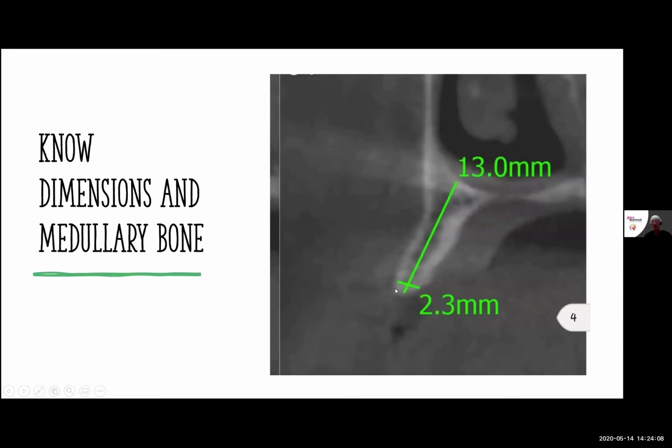And so I am not talking with this technique of growing a little bit of bone like this. Another millimeter of bone is going to do us nothing except cause irritation to the patient. This patient needs to have 6 to 8 millimeters of bone growing on the facial surface of this in order for us to consider placing an implant. That's what I'm talking about, growing that amount of bone in this area on this patient, so that we're going to be able to have space and a place to place our implants that are going to be predictable.